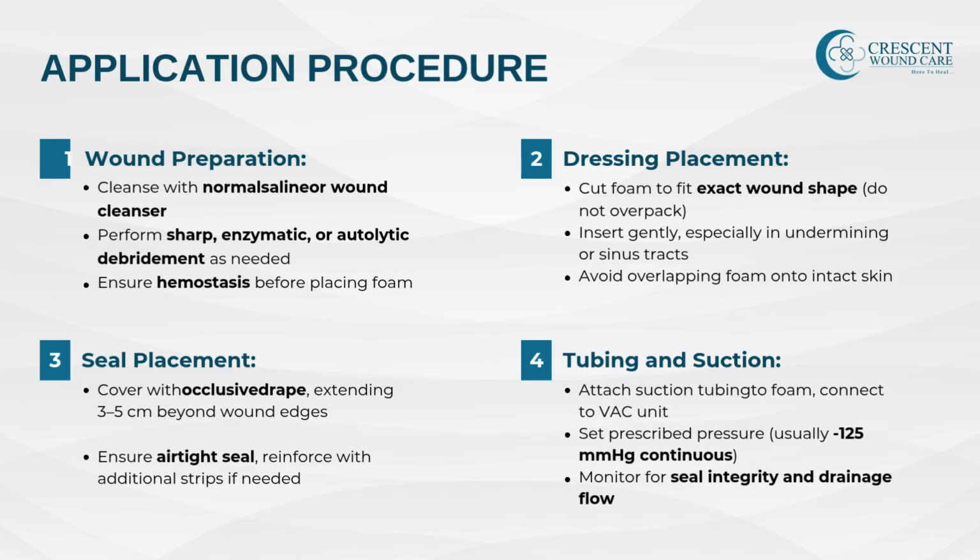The correct application of NPWT is both an art and a science. Here's a step-by-step outline for safe and effective setup. 1. Cleanse the wound. Use a prescribed solution to clean the wound bed and surrounding skin. Perform debridement if needed to remove non-viable tissue.